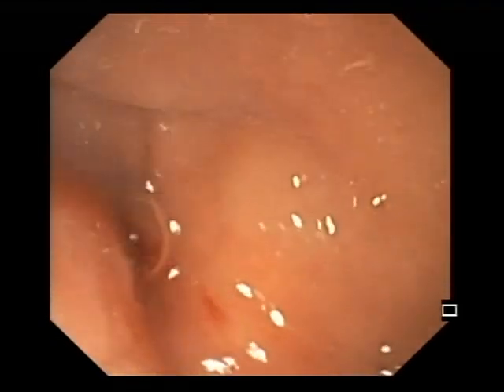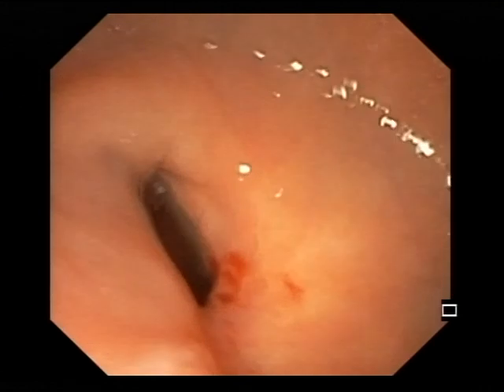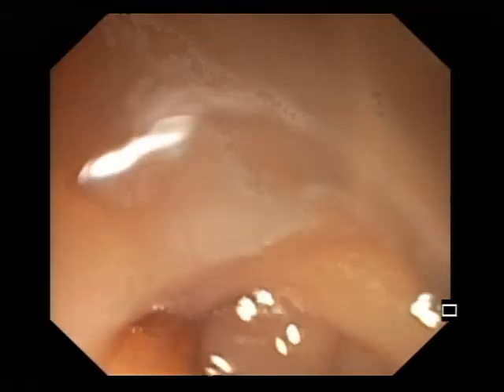Here, the camera is on the side. I'm going to see if I can take a look endoscopically first. It looks like there is some tumor remnant there, or it's just scar tissue. That's the area where it looks like. I don't see anything else beside that. This is just the anal area right there. You see a little bit of stenosis there. So I will move the scope up a little bit to try to go through that stenosis. You see that it's moving through slowly.